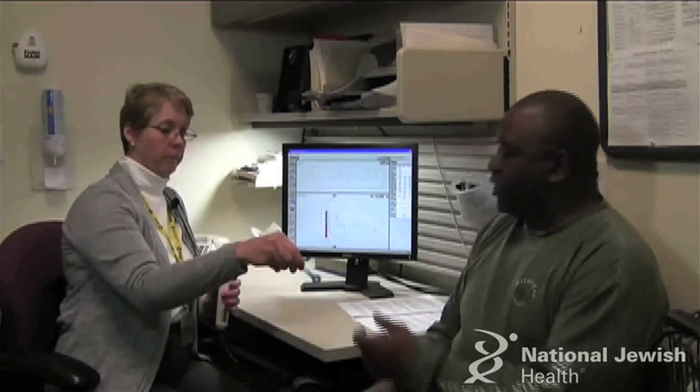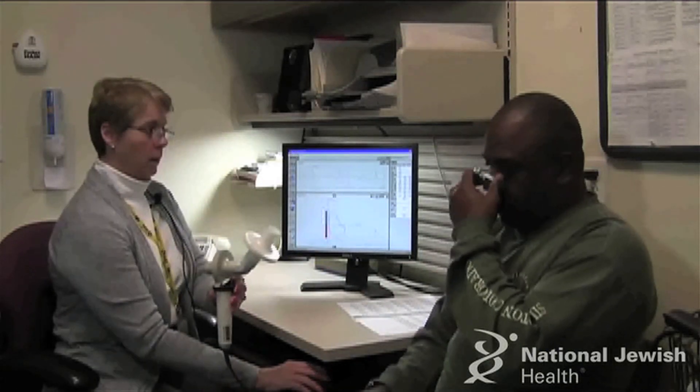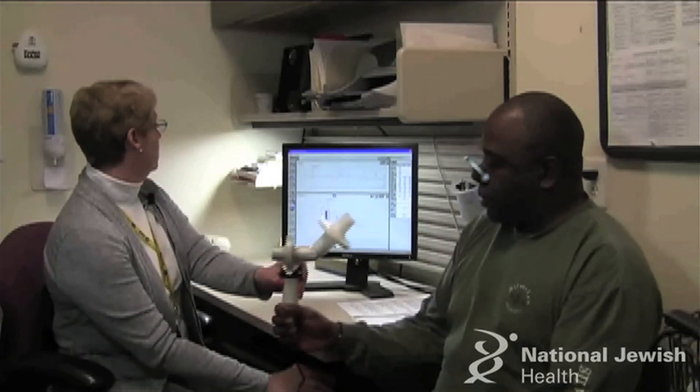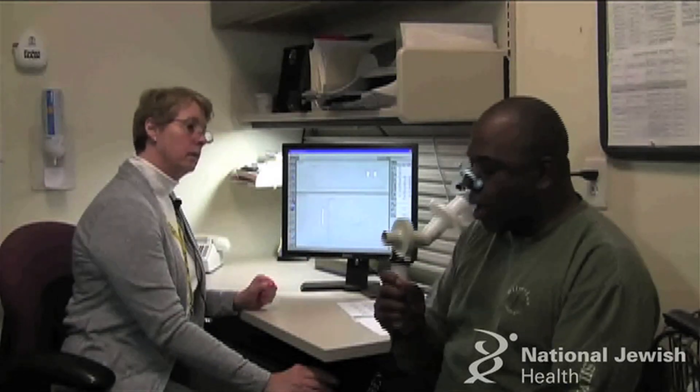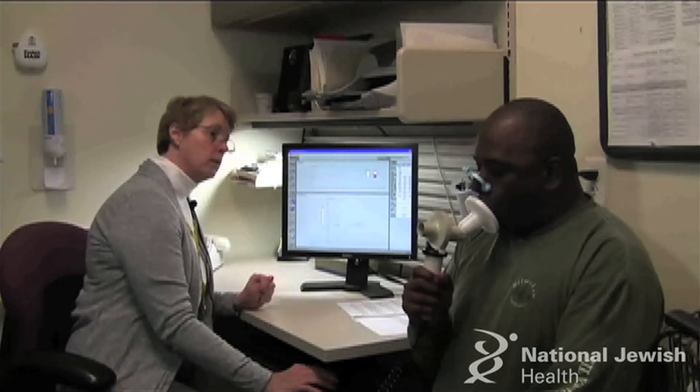Okay. You ready? Ready. Put nose clips on your nose. Get the mouthpiece in your mouth. Get a good seal — just pretend you're sucking water through a straw and you get a nice good seal.